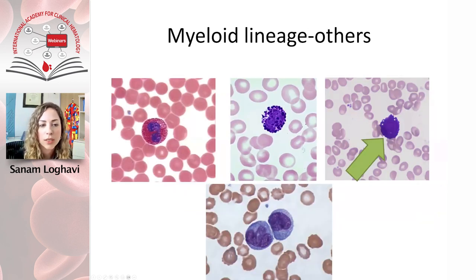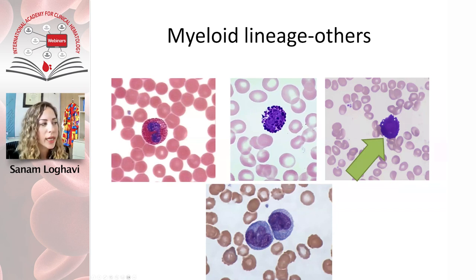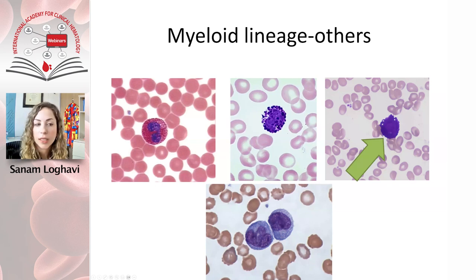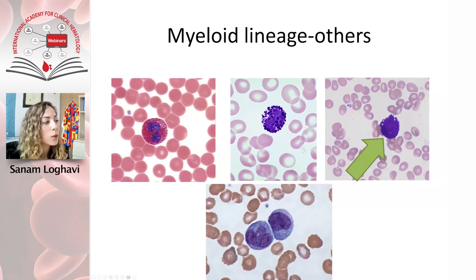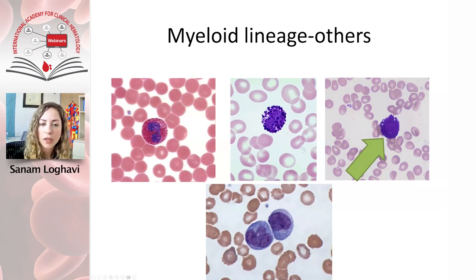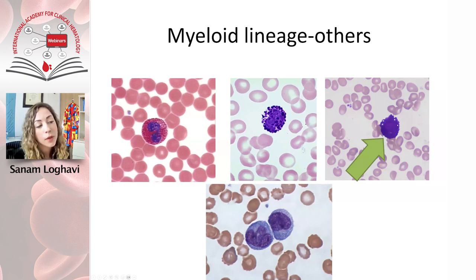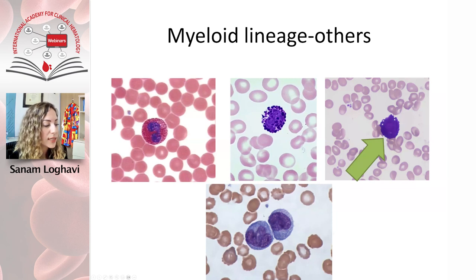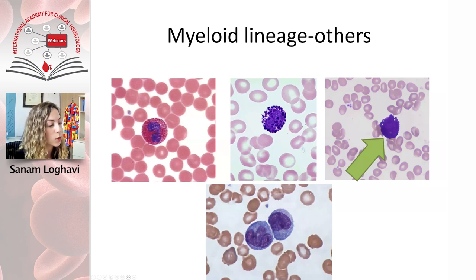Let's look at other myeloid lineages. Here's an eosinophil, a basophil, and a mast cell. A common trainee question is how to differentiate a mast cell from a basophil — both have basophilic granules. In a basophil, you can still see the nucleus and the granules are very coarse. In a normal mast cell, the granules cover the entire nucleus making it very difficult to see, and the granules are finer but equally purple. Here are also a couple of reactive-looking monocytes with more blue cytoplasm than normal.